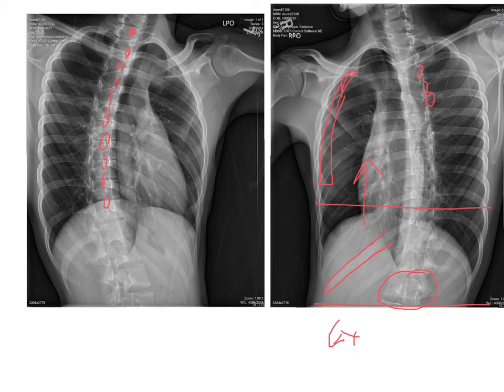I guess the last thing I have for you today is, remember, on our test next week, you can have just a unilateral side. If you get a unilateral image, make sure that you write that in the projection name. So if this were the unilateral that we had, you would write RPO/LAO above diaphragm unilateral ribs.